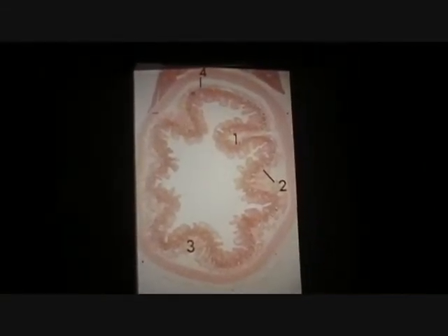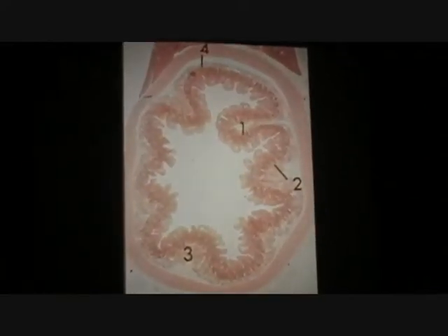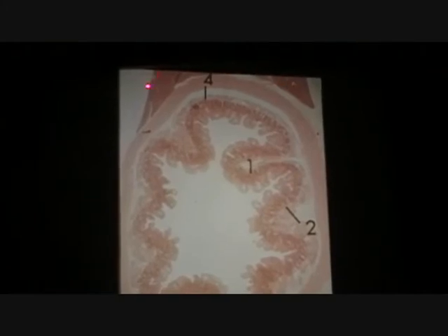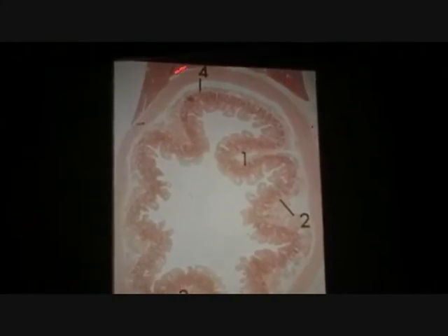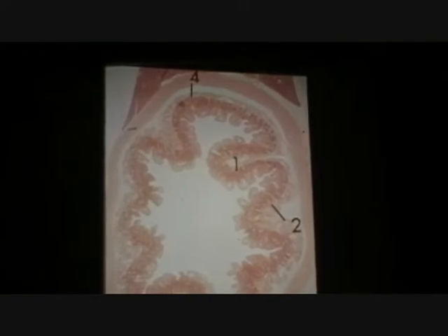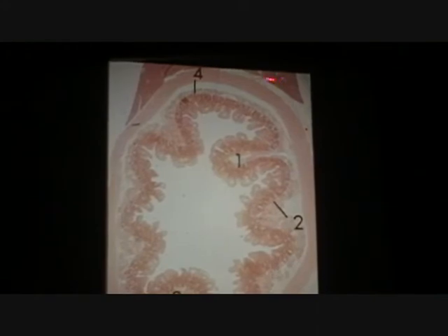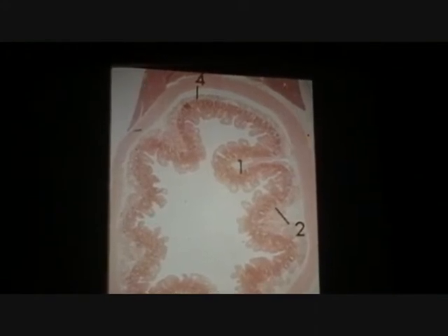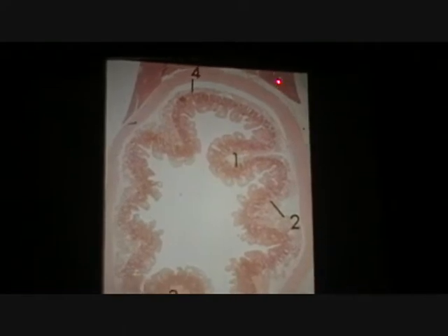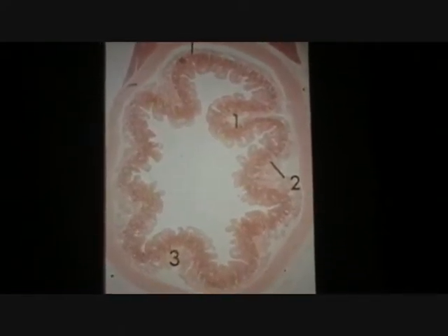If you're really a histology savant, you might know what this is. Don't worry about it. You really have to have a great sense of histo relative to gross to know what that has to be. If this is duodenum, this is a tissue that's tucked right into it. Caught it, just the edge of it in the section.